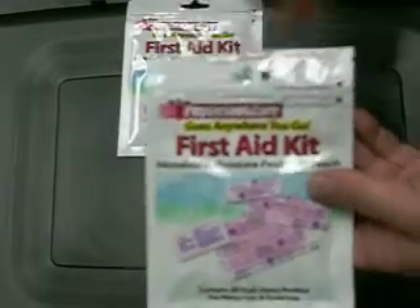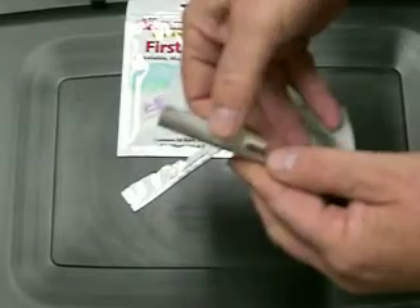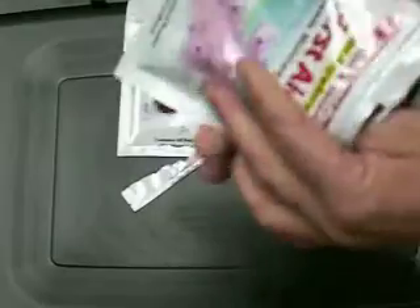So let's get into this. To open it up, all you do is grab the little tear here, rip it open like that, and open up the package. There it is — all my first aid supplies are clean and ready to use.